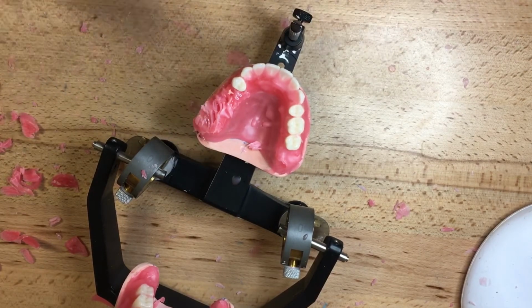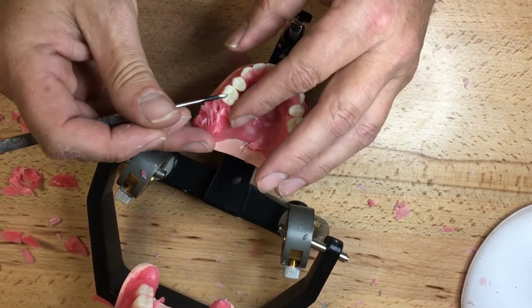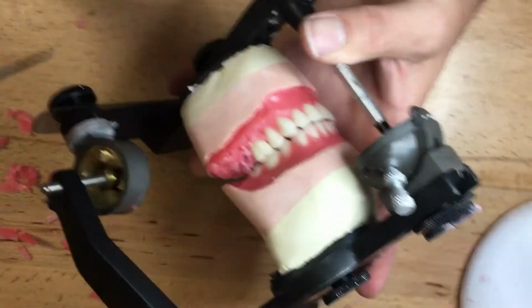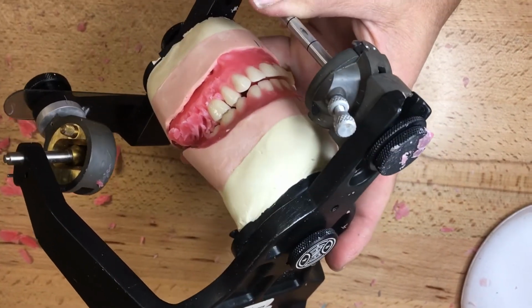I think it's really helpful if you have alcohol in your alcohol torch and wax in your wax pod. The wax is somewhat soft. If we're going to get serious about doing the denture setup, then make sure that you have anticipation to finish what you started. And we're going to start with conviction.